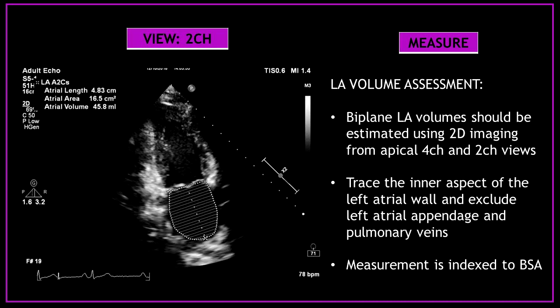Now continue and perform a left atrial volume assessment. Left atrial volumes should be estimated using 2D imaging from apical 4 chamber and 2 chamber views. Trace the inner aspect of the left atrial wall and exclude the left atrial appendage and pulmonary veins. All measurements need to be indexed to body surface area.